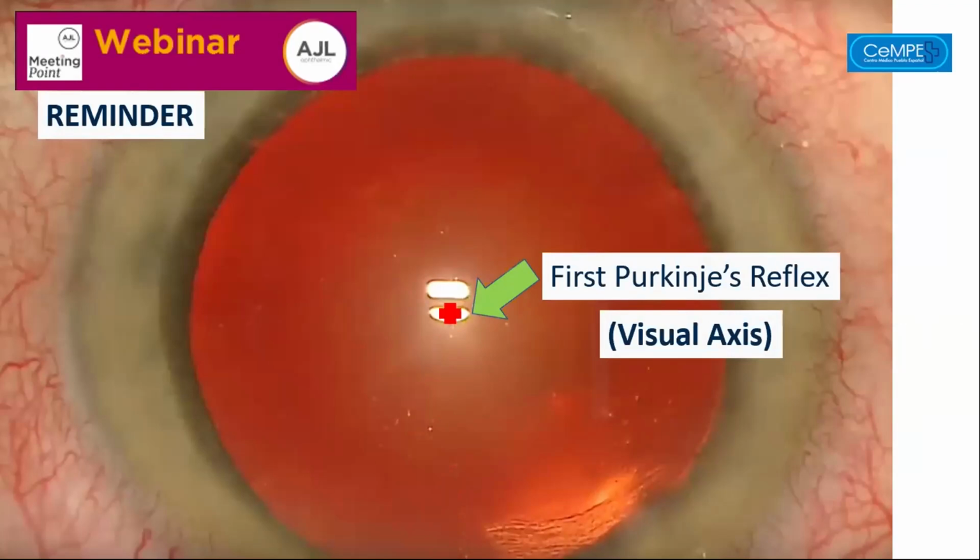So this is just a reminder. We'll do a quick reminder. When you are at surgery, you have the first reflex. This is the reflex on the cornea. The patient is fixating his vision with the light of the microscope, and you assume this is the visual axis.